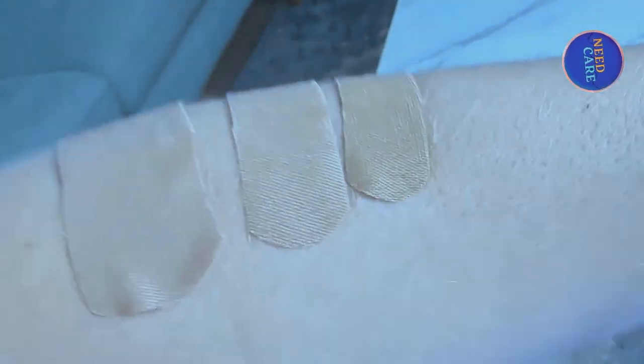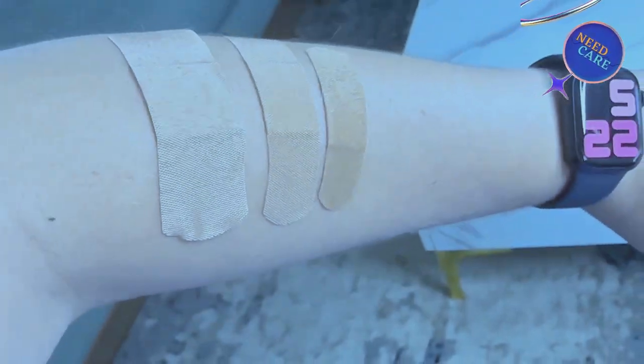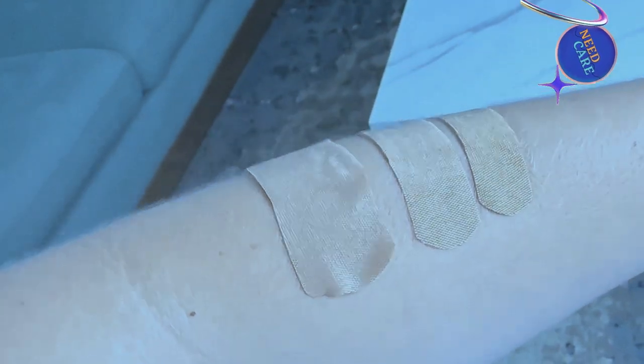So this is going to be great for younger children or for face injuries or anything like that, because you do have the multiple sizes. This box here includes 25 of the three by one inch, 35 of the three-quarter inch, and 40 of the five-eighths inch. So they come with a multiple assortment and you can choose which one you want.